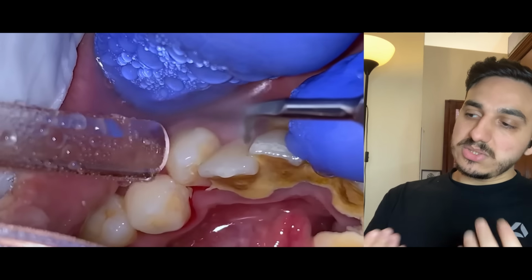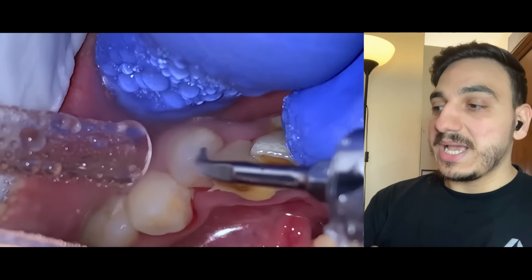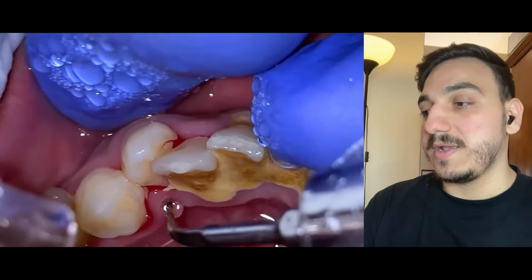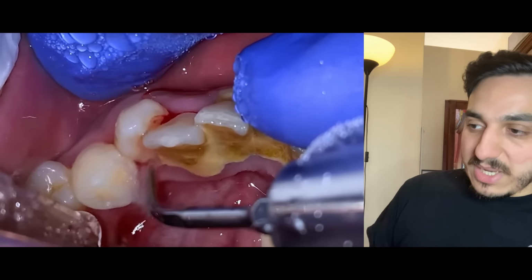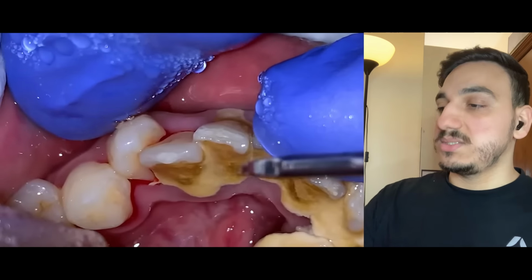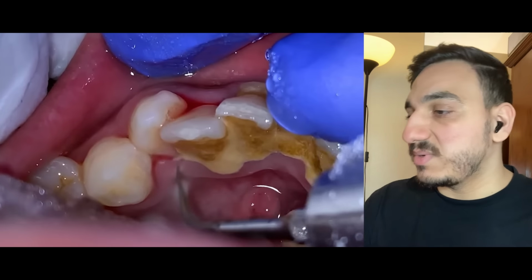You can see also this person has crowding, which makes it even more difficult for the person to clean, and it also limits accessibility to certain areas for the dentist who is doing that dental scaling and cleaning procedure.